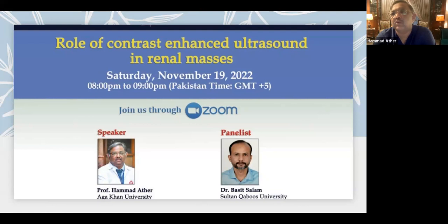CBU of 19th of November. And today we are going to talk about the role of contrast-enhanced ultrasound in renal masses. My only disclosure is that I am a urologist and not a radiologist.